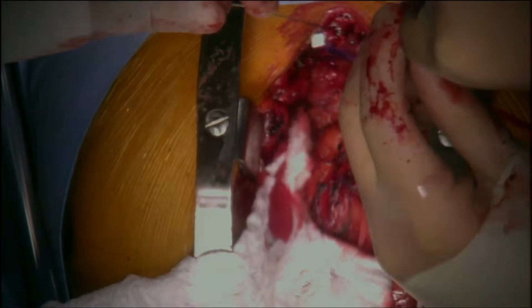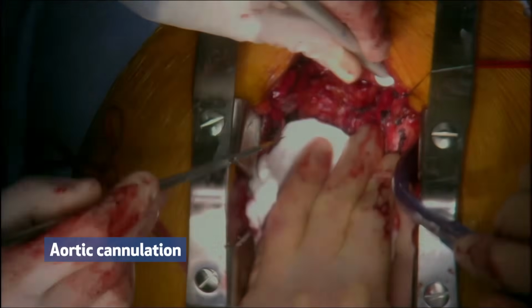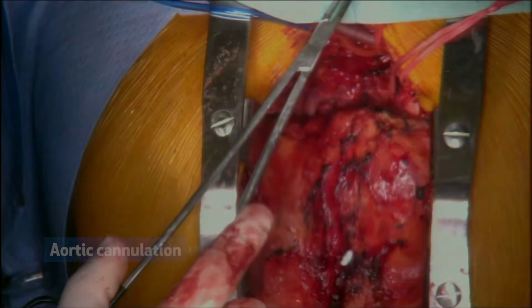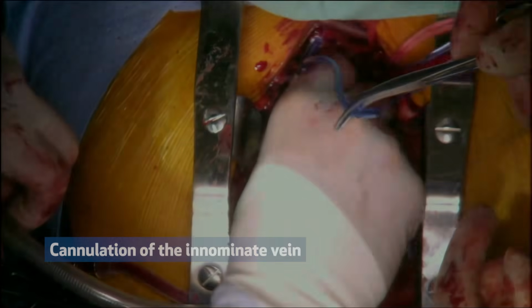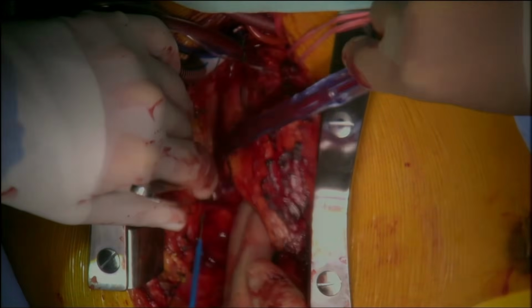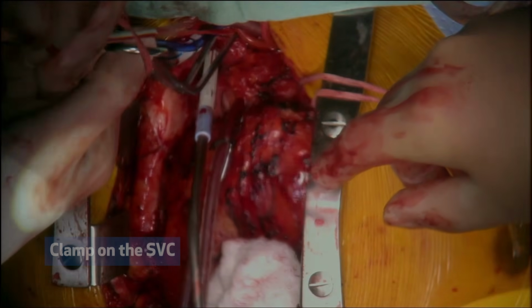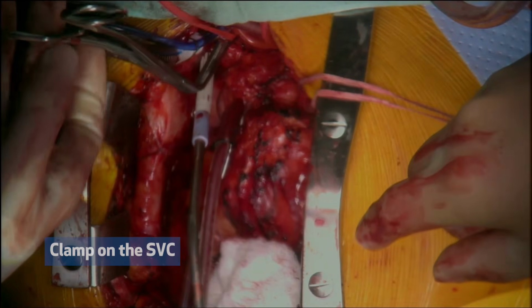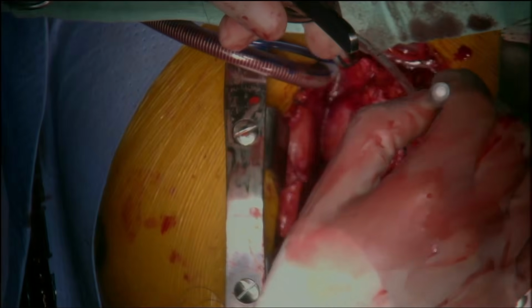In this case, we decided to establish a cardiopulmonary bypass with an arterial line into the aorta and the venous line into the innominate vein. Here we are positioning a vent into the pulmonary artery, and then we position a cannula into the innominate vein. A clamp was positioned on the SVC, and then a clamp was positioned on the aorta.